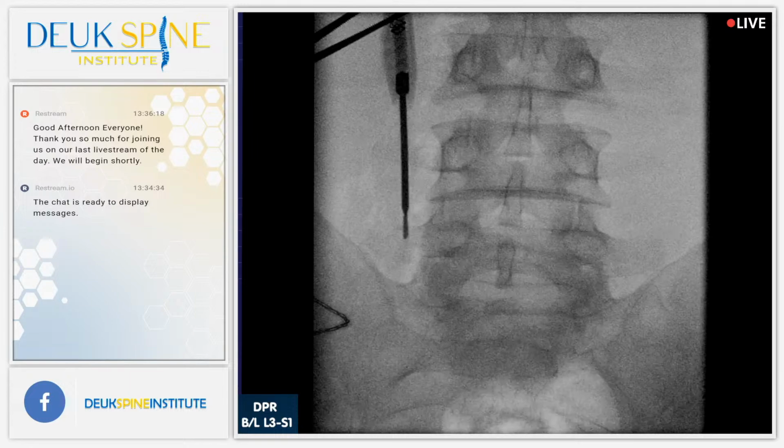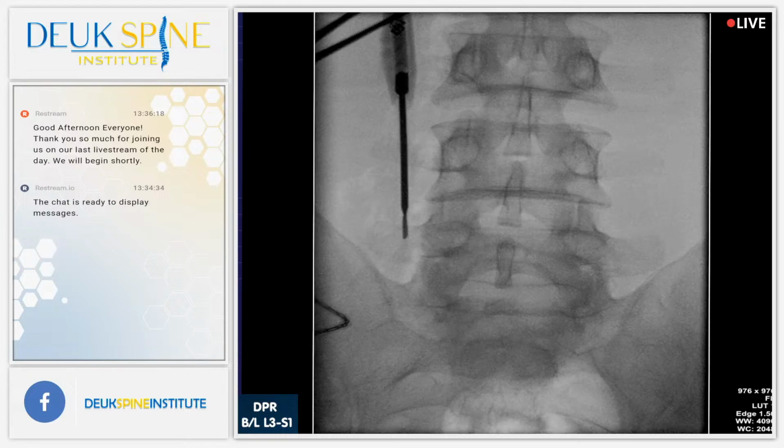All right, good. So I'm just marching along the TP a little bit, making sure we get that nerve, because that nerve is what's causing his pain.